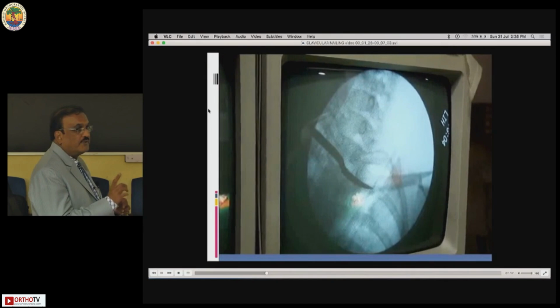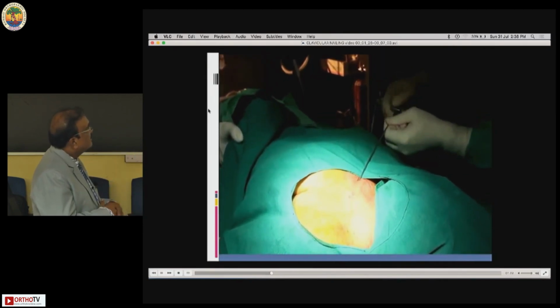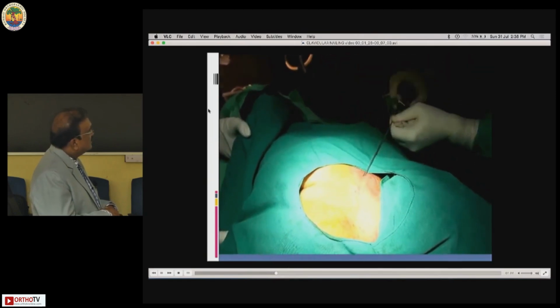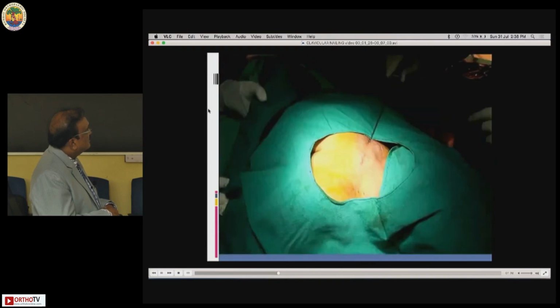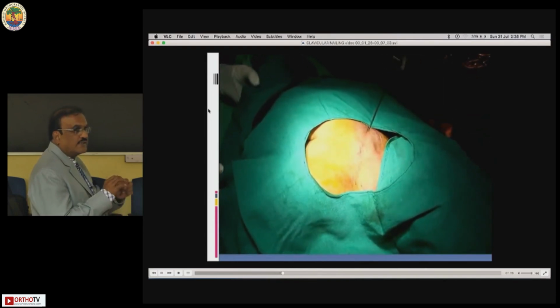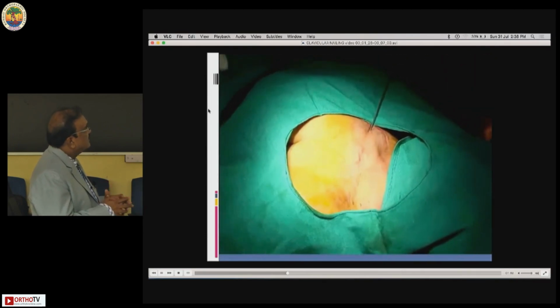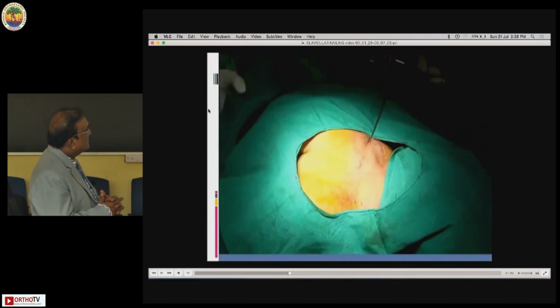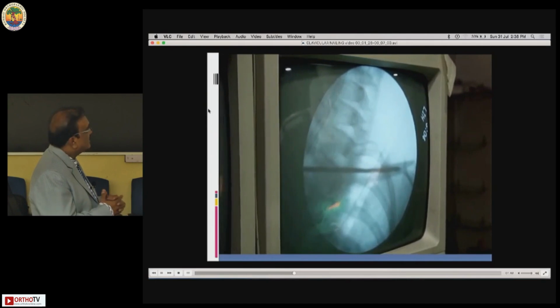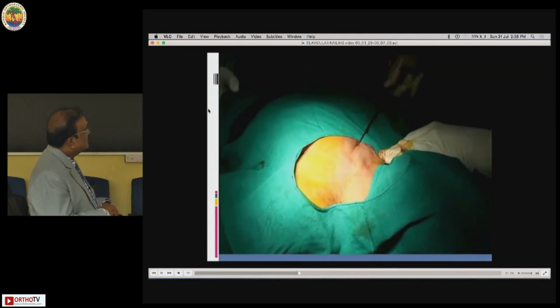And then you can feel if it is inside the canal, you can manipulate the fracture fragment, and this is the reamer. We have to ream till the proximal fracture site. When there is a curvature, there is a difficulty in reaming also. You may get a resistance, so that you require a flexible reamer. Now you can see this is the place where there is a difficulty in reaming because of the curvature. So it takes time for negotiation of the reamer also at that fracture site junction.